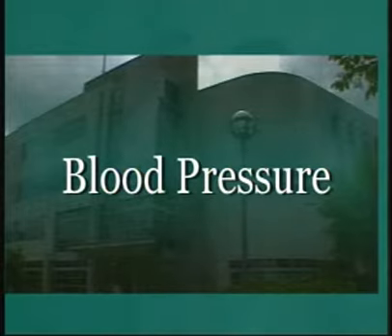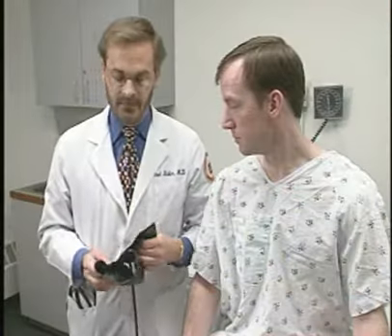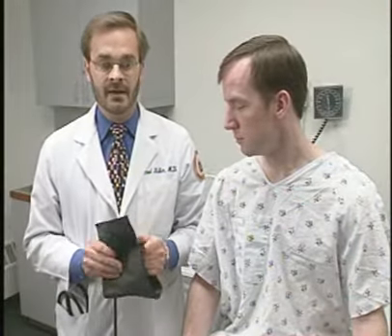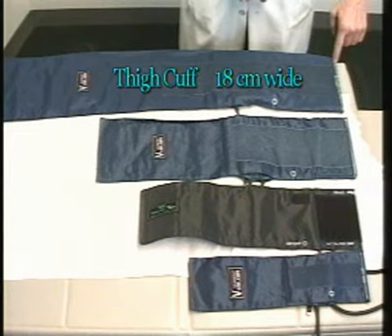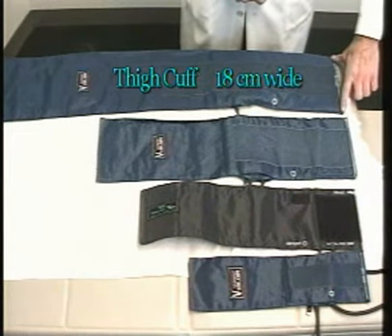You, of course, need a sphygmomanometer with a blood pressure cuff. And of course, a blood pressure cuff is not one size fits all. The largest blood pressure cuff is known as a thigh cuff, although this can be used on a patient who has a very large arm. The width of this cuff is approximately 18 centimeters.